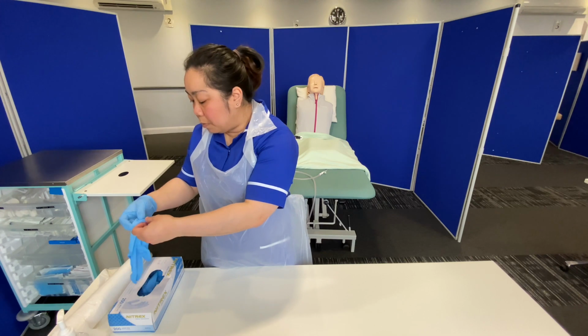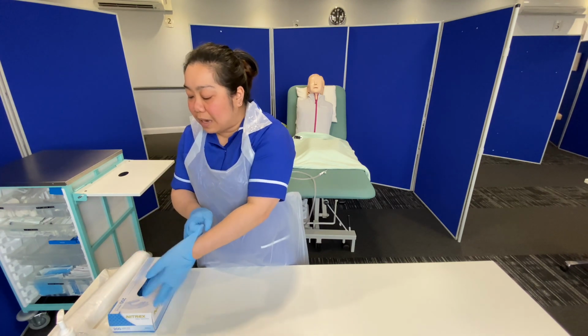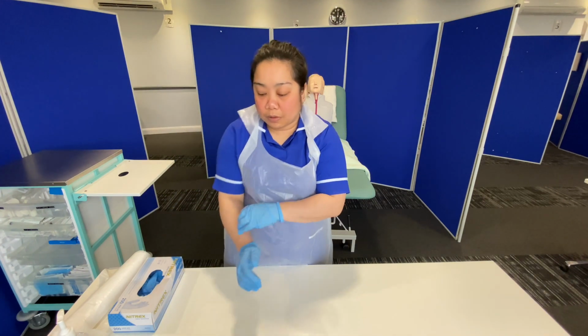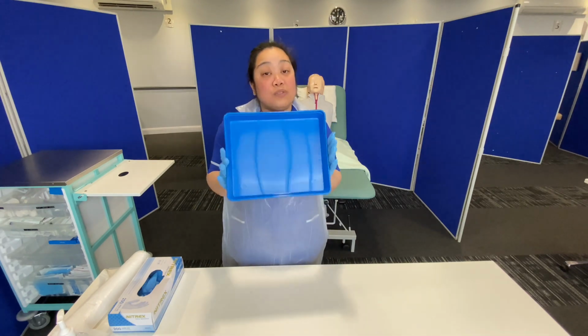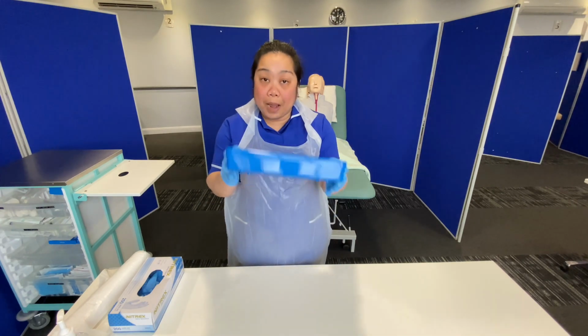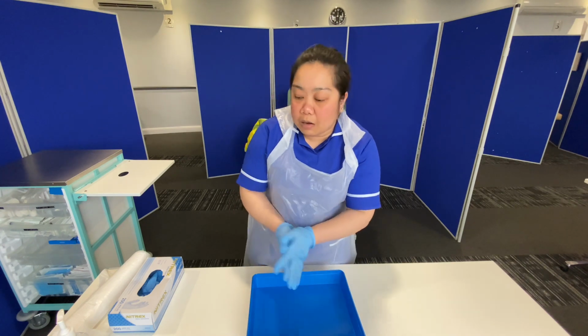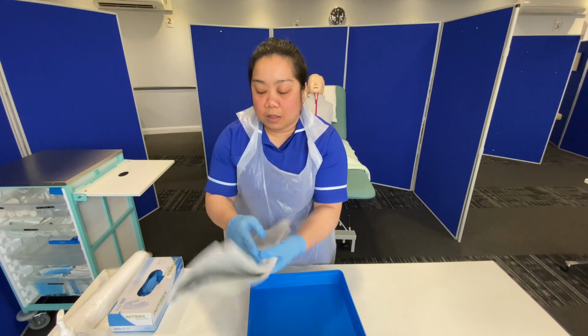Right, I will need to prepare a tray, which I will need to check with the examiner if it is disposable or reusable. It's disposable. Right, so it's disposable and I can see that it's visibly clean and dry, so I'm happy to use that. Along with this, we will need an underpad to place underneath the catheter.